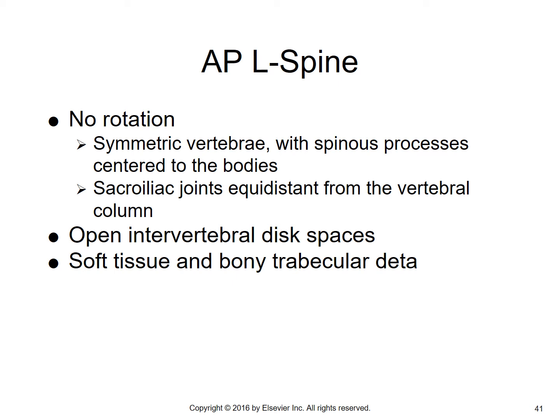Sacroiliac joints are equidistant from the vertebral column. Open intervertebral disc spaces are demonstrated, and soft tissue and bony trabecular detail.